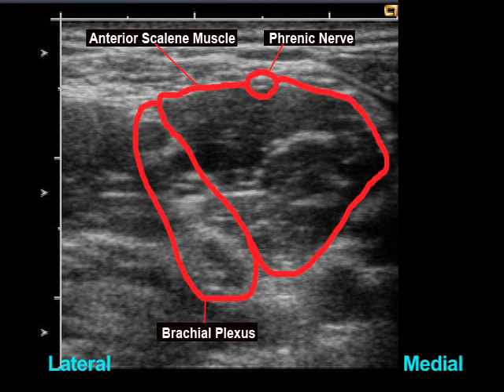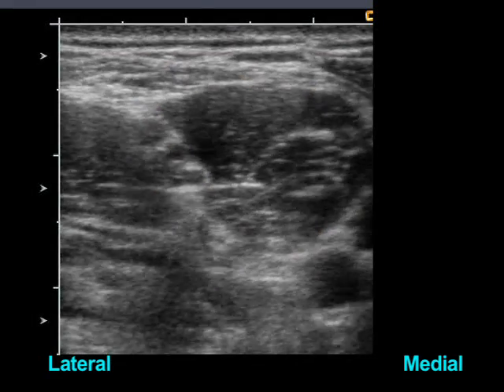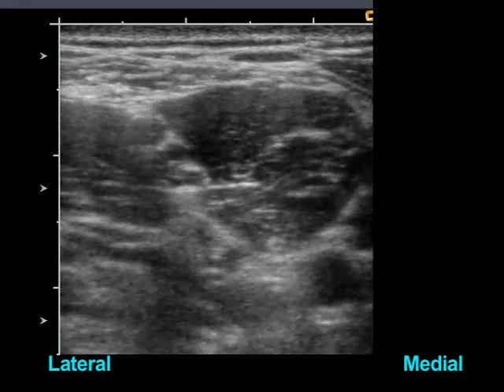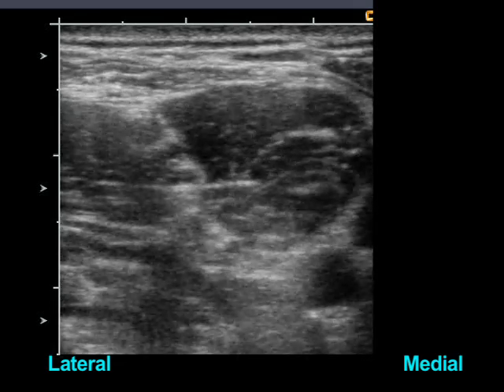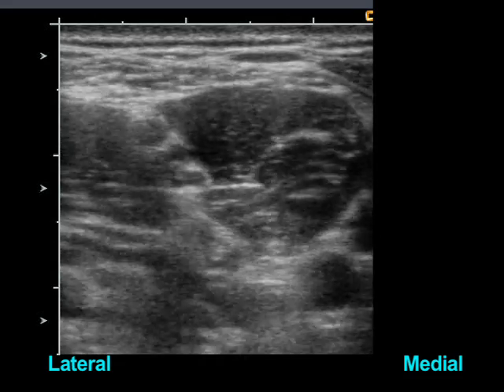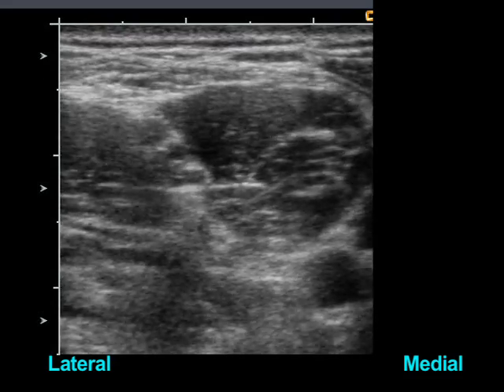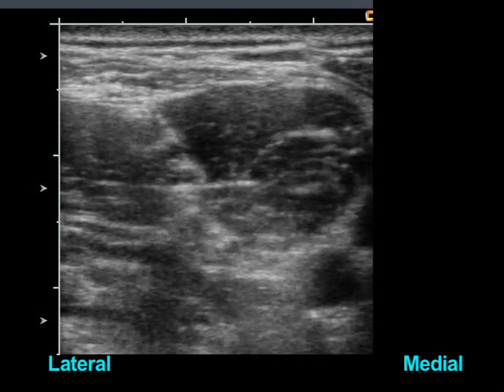The phrenic nerve is a small monofascicular nerve that crosses over the surface of the anterior scalene muscle. As the transducer slides toward the chest, the phrenic nerve is seen to diverge medially from the brachial plexus. Because the pre-vertebral fascia covers the brachial plexus and phrenic nerve, local anesthetic injections often distribute to both.